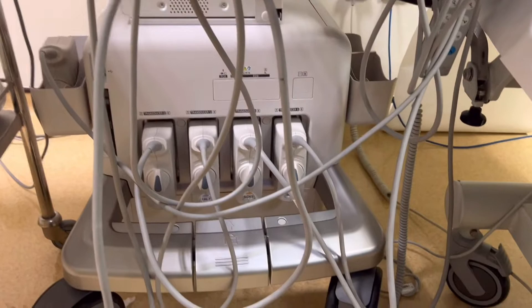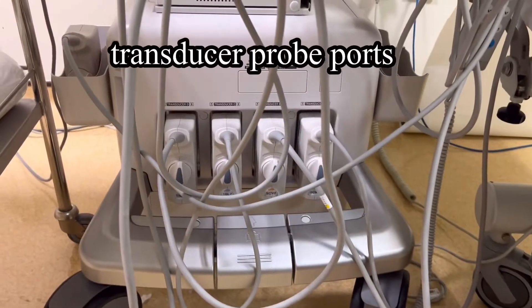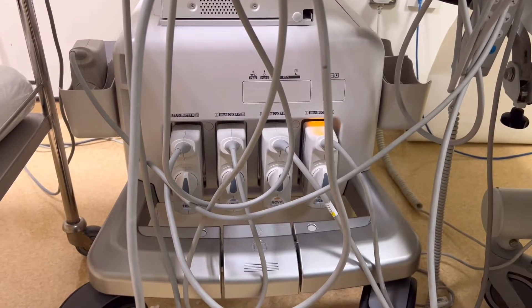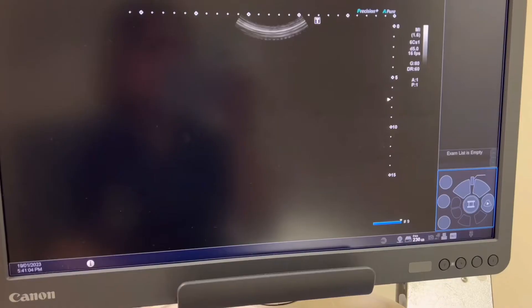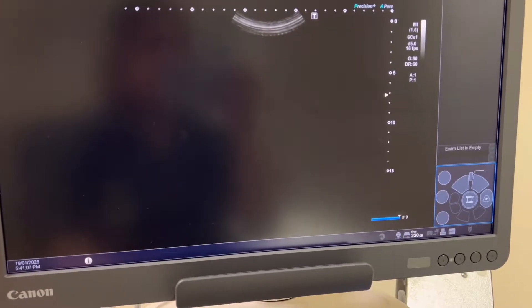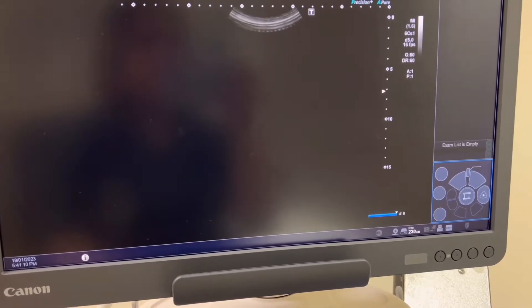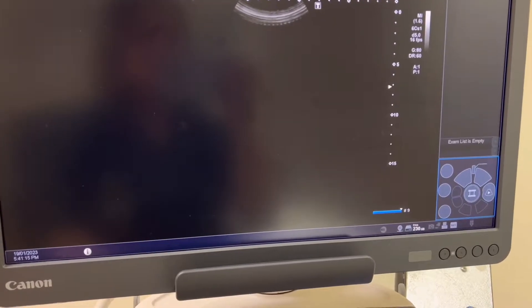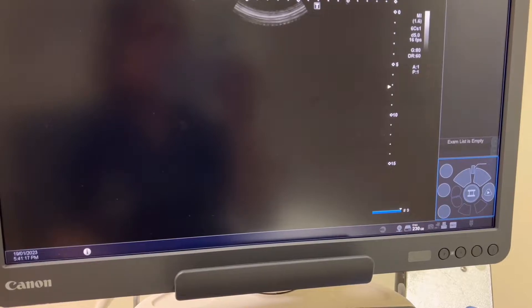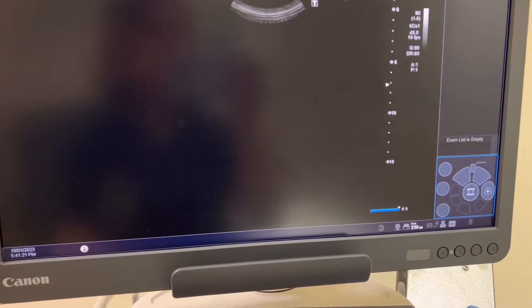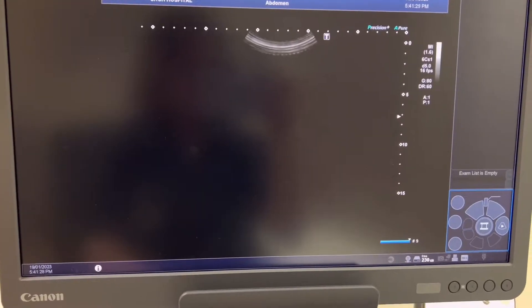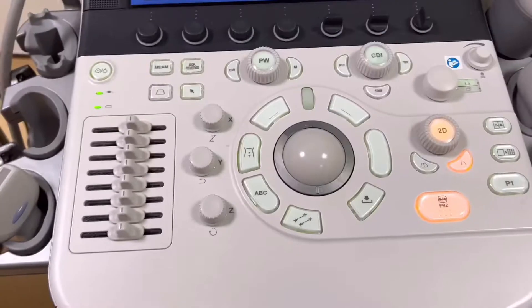The various ultrasonic transducers are connected to the machine's CPU through these ports. Different information can also be shown on the display screen or the monitor. This includes the mechanical and thermal index values, the kind of probe used and the frequencies associated with it, and any other relevant details — including the patient's name, identification number, and the facility.